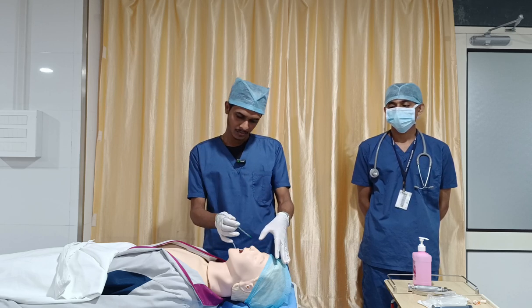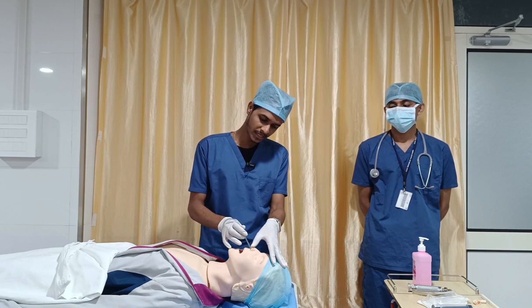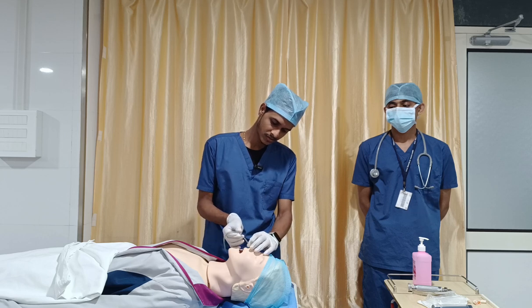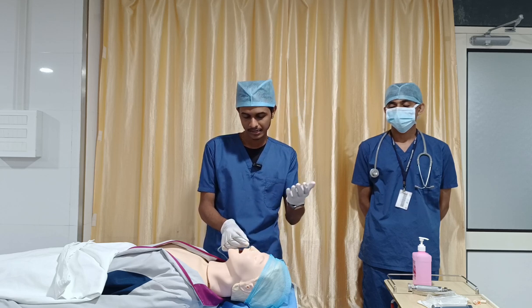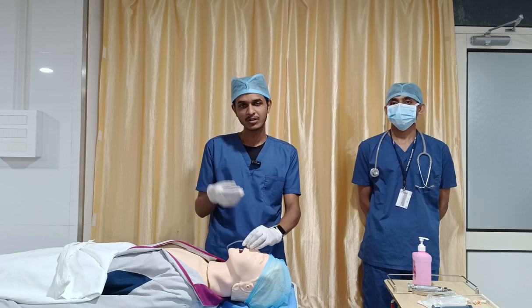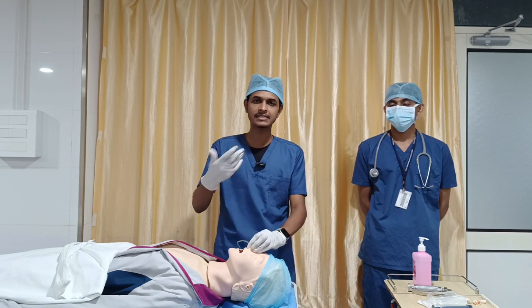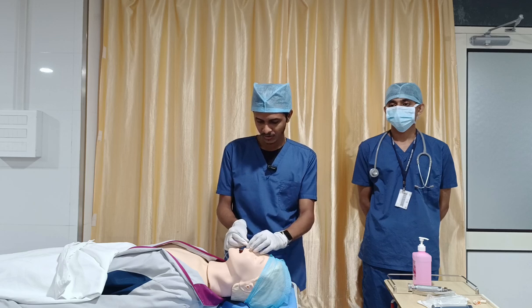Okay. So if the person doesn't have any deviated nasal septum, I am going into the right side. So slowly introduce the catheter. Slowly introduce the tube. If the person is conscious, oriented and able to swallow, you can give a small amount of water. If the person is able to swallow, during the swallowing you can facilitate and easily insert the catheter. So slowly insert, slowly insert.